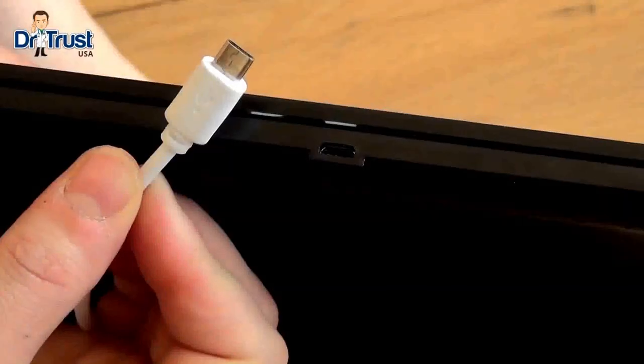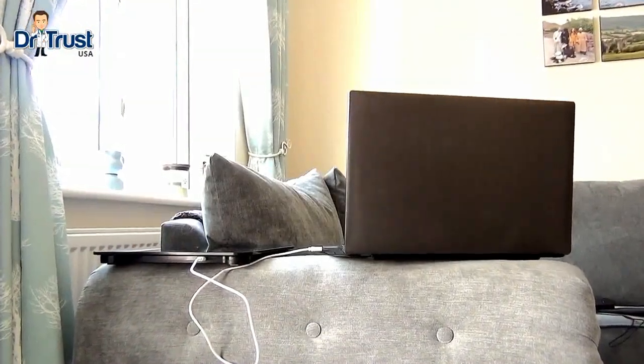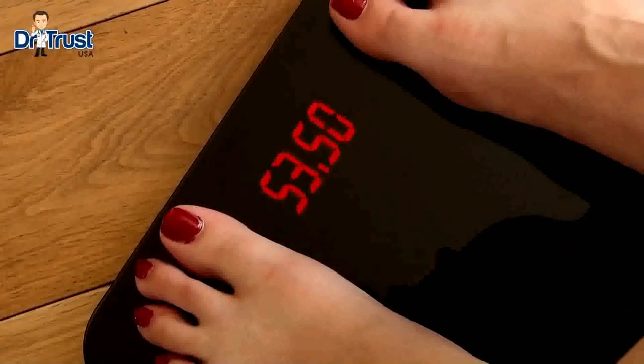With a built-in long-lasting rechargeable battery and included USB cable, you can charge your scales from your laptop, tablet, or even a wall adapter without ever needing to buy new batteries.